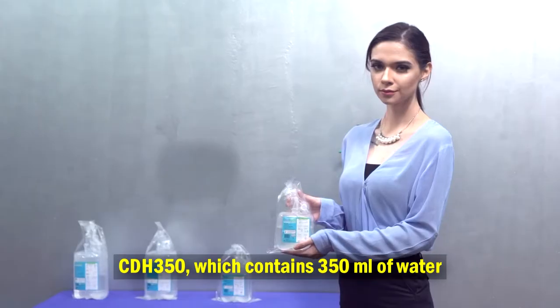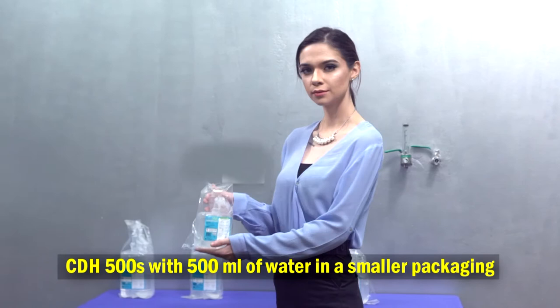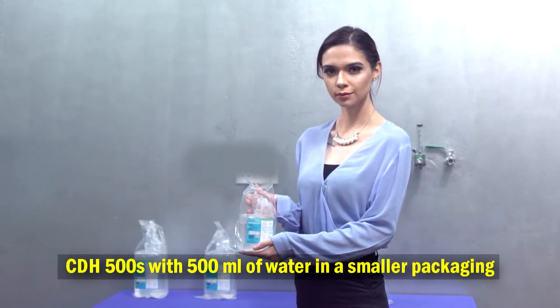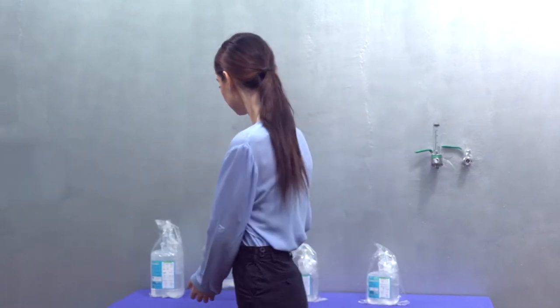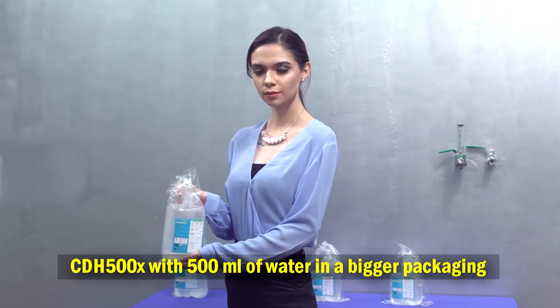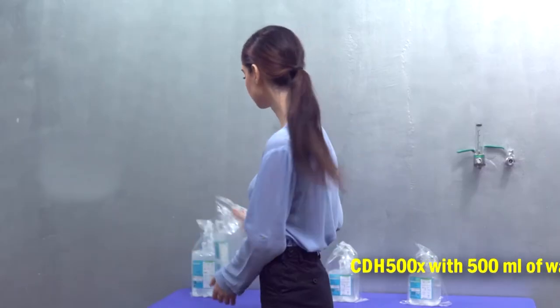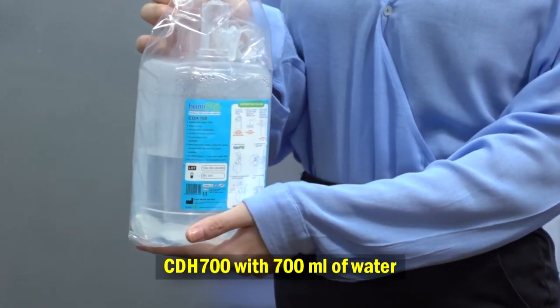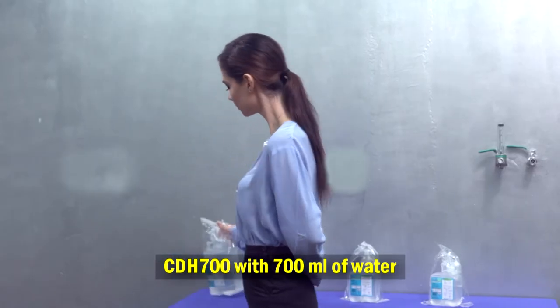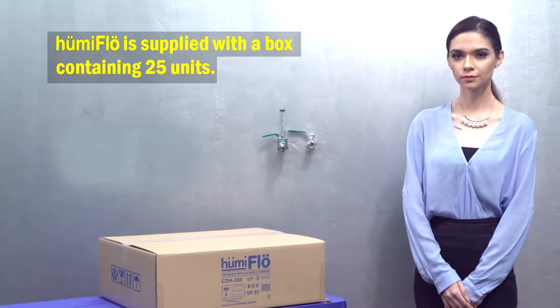Humiflow has four variants of model. They are CDH 350, which contains 350 milliliters of water; CDH 500S with 500 milliliters of water in a smaller packaging; CDH 500X with 500 milliliters of water in a bigger packaging; and CDH 700 with 700 milliliters of water.